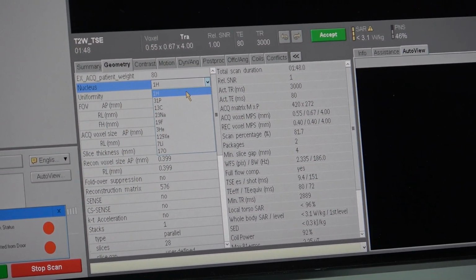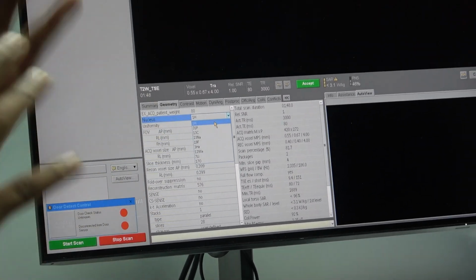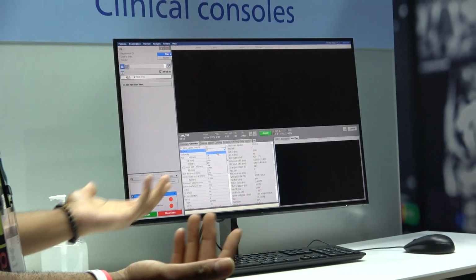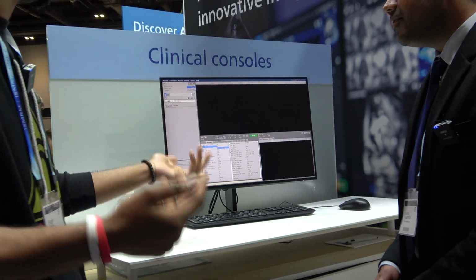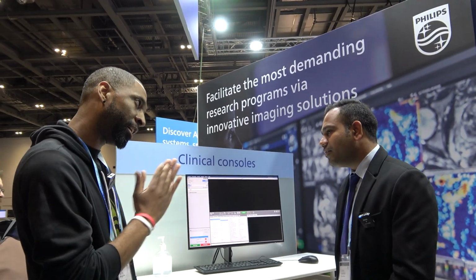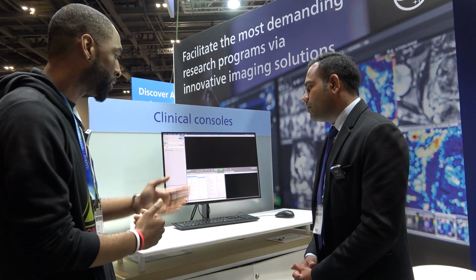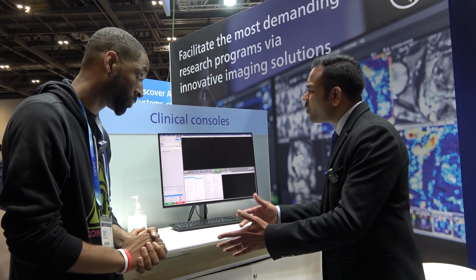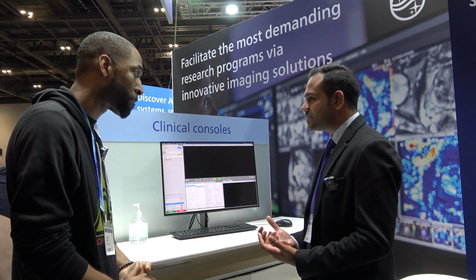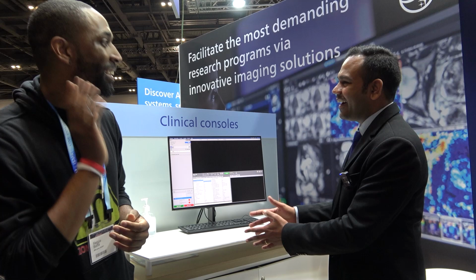In the past, you needed to switch off and switch on to change. The workflows were terrible. Now, we use the hydrogen proton because it's the most abundant, and we get our signal from there. Do we lose any signal when we switch the molecules? How do you compensate for the lack of abundance for some of these other molecules? That's why the scan times are a little longer on the multi-nuclei sequence. I see, because the natural abundance is less, you need to scan a little longer than you would on hydrogen. Just got to listen to those protons a little bit longer, right?